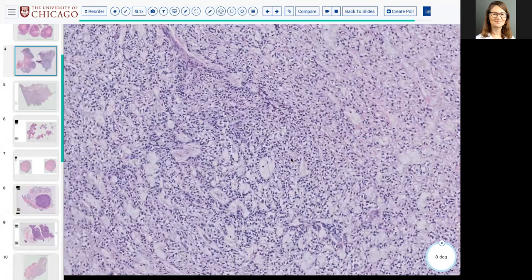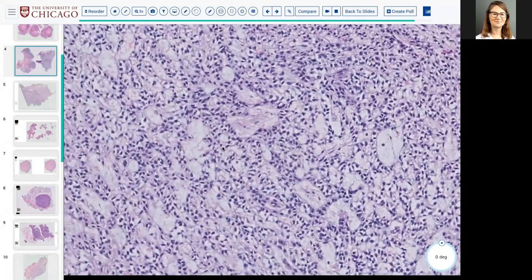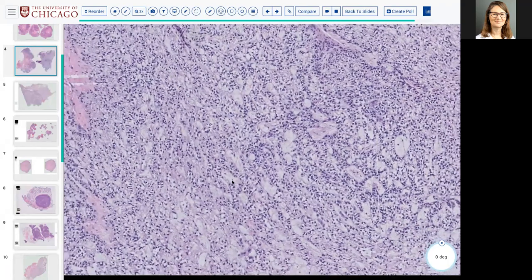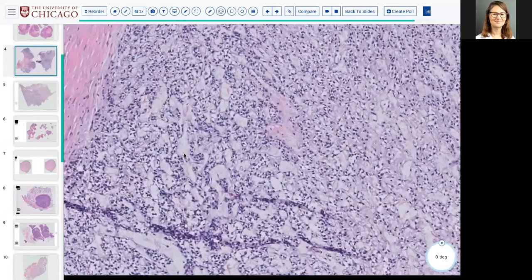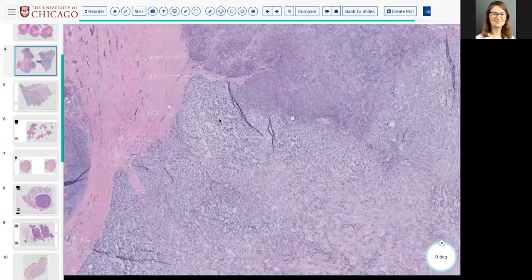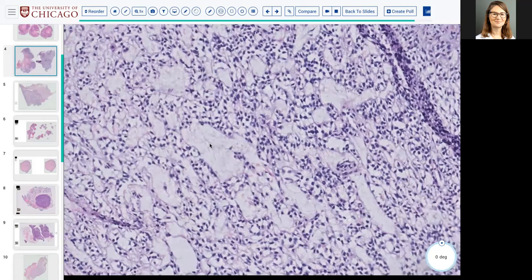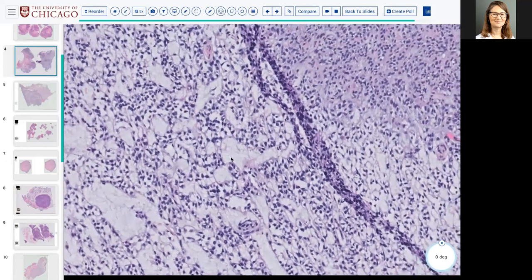Is this intraepithelial mucin or connective tissue stromal mucin, which may differentiate mucoep from a myoepithelial-rich lesion? Intraepithelial mucin should be considered true mucocytes, such as in mucoep or in mucinous metaplasia. But bluish stromal or connective tissue mucin is generally produced by myoepithelial cells. I think this is not intraepithelial mucin, and most of you probably think these are myoeps with clear cytoplasm and stromal mucin.